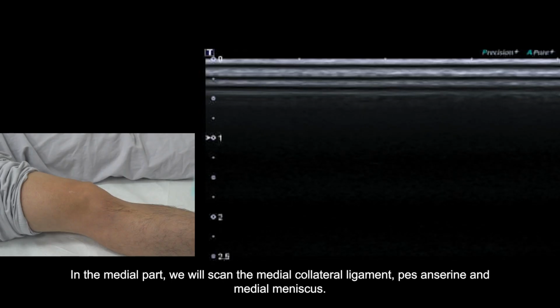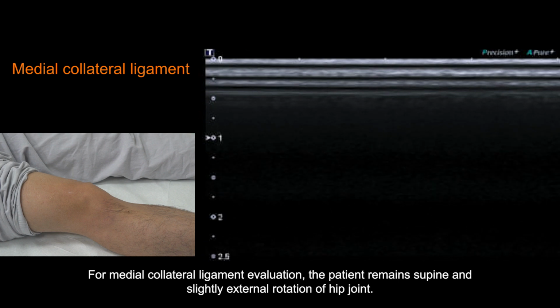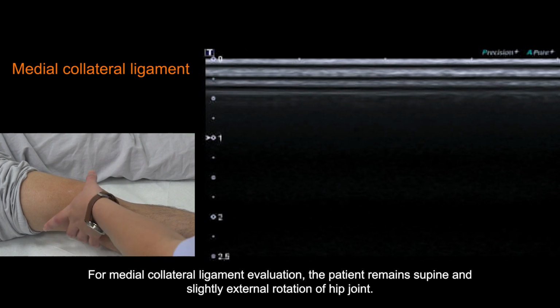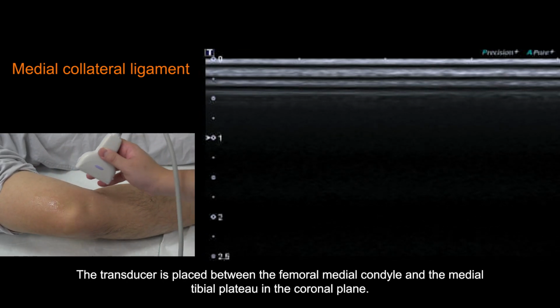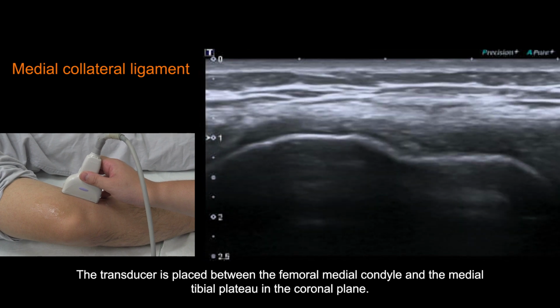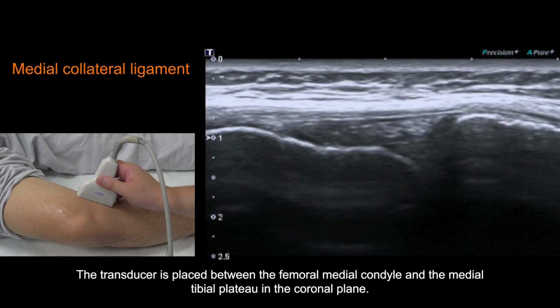In the medial part, we will scan the medial collateral ligament, pes anserine, and medial meniscus. For medial collateral ligament evaluation, the patient remains supine with slight external rotation of the hip joint. The knee is in about 20-degree flexion. The transducer is placed between the femoral medial condyle and the medial tibial plateau in the coronal plane.